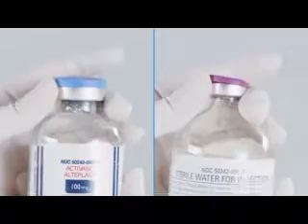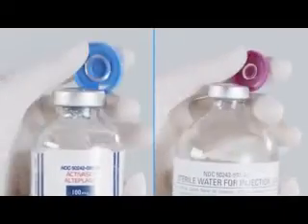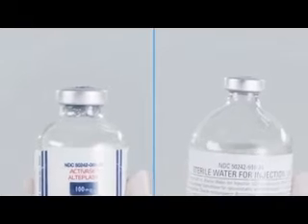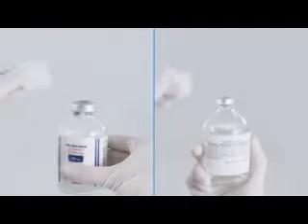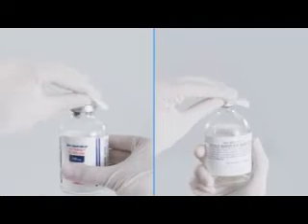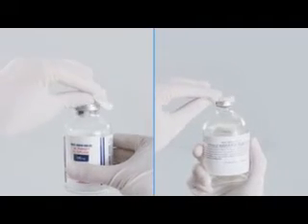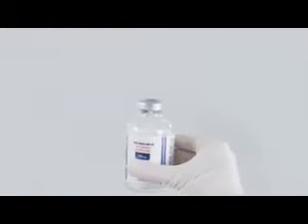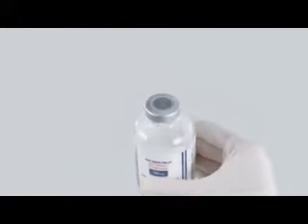Begin by removing the protective caps of the Activase powder and the sterile water for injection, and swab the top of each vial with an alcohol wipe to reduce the risk of contamination.